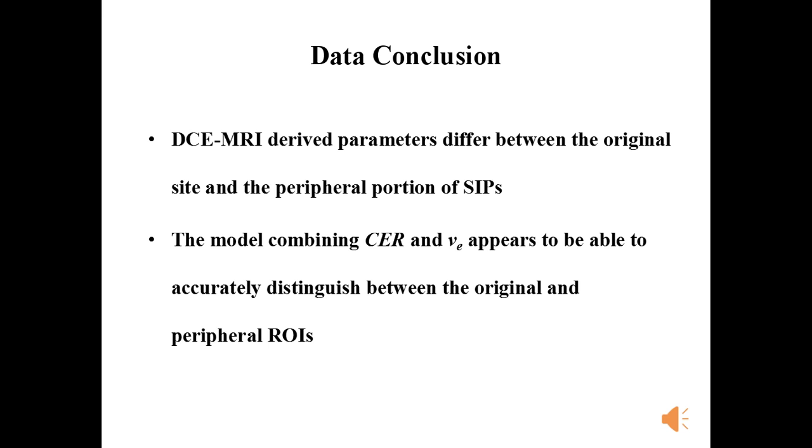In conclusion, DCE MRI derived parameters differ between the original site and the peripheral portion of sinonasal inverted papillomas. The model combining CER and VE appears to be able to accurately distinguish between the original and peripheral regions of interest.